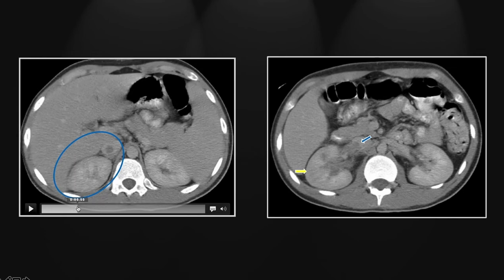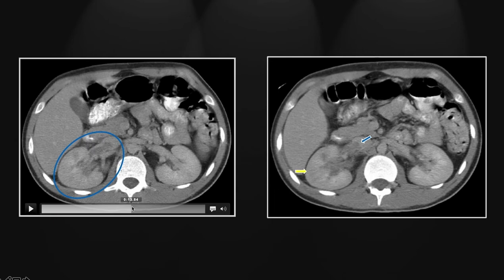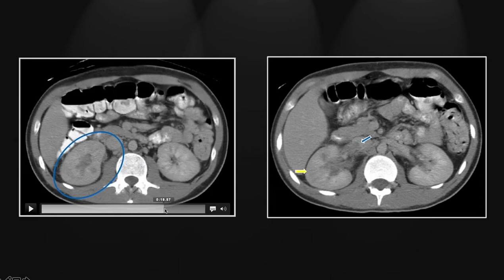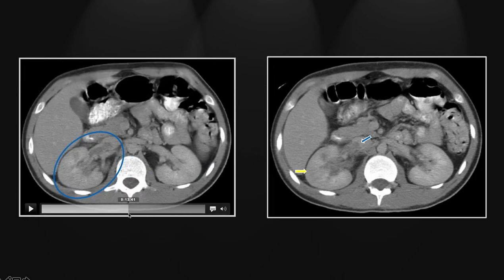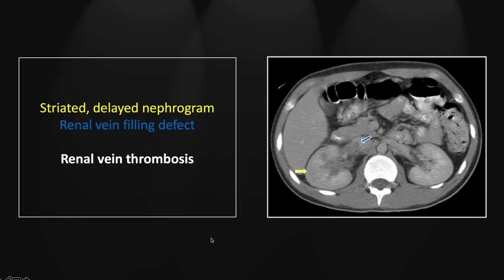Here you can appreciate the heterogeneity of the right nephrogram, most notably right here, and that small fluid collection, which may just represent a small focus of ischemic necrosis. We'll go back up and appreciate the extensive filling defect within the right renal vein sticking out into the IVC. So that's a case of renal vein thrombosis, most likely related to a febrile illness and dehydration.